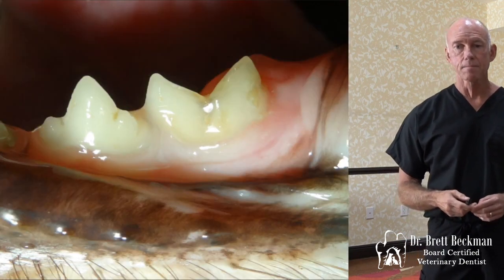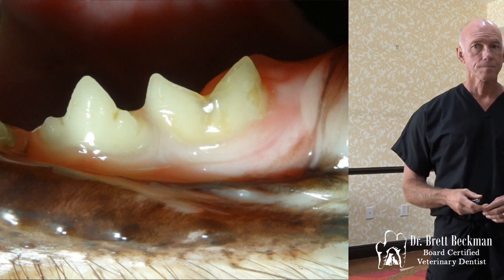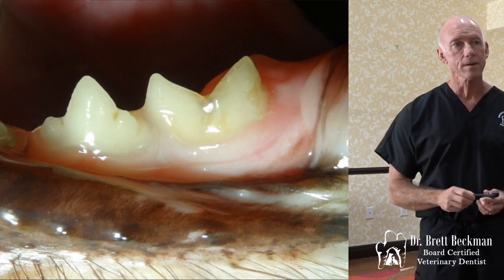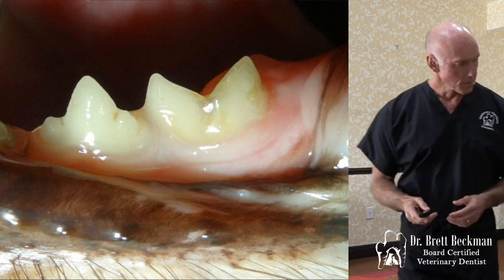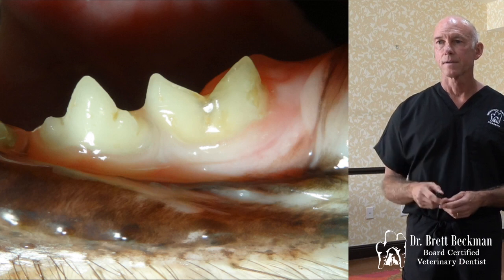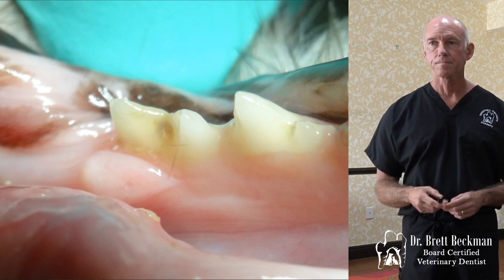All right, so this one's not as obvious as the one you just saw. That looks pretty good, right? Anybody see anything there at all that they'd jump on? So right there? Yep. Good call. That little tan area right on the distal aspect of that distal crown makes you start thinking there is some change there. And looking at it from that side, it looks pretty good, right?